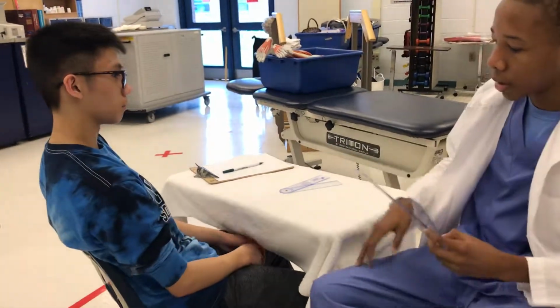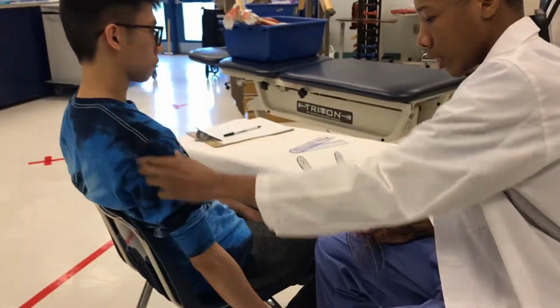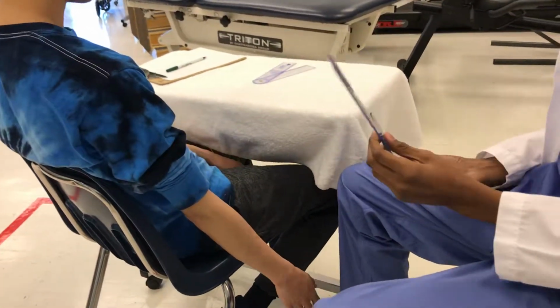So now I'm going to ask the patient to bend their elbow into extension, repalpate the bony landmarks, acromion process, lateral epicondyle, and the radial styloid process, and realign the goniometer.